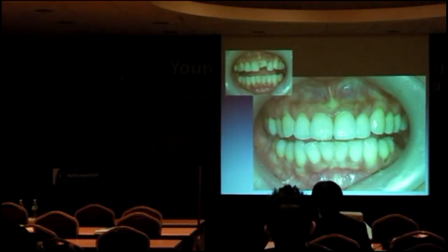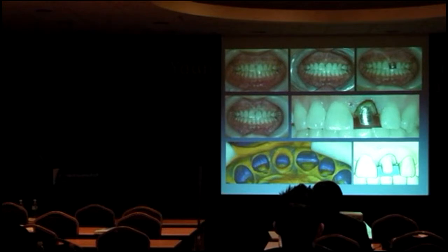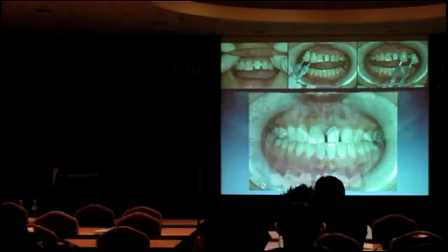This is the end of the single tooth case. The other single crown has a metal porcelain core, which may affect the result because of the metal reflection during the intraoral scan. I made the conventional impression with polyvinyl siloxane, and I also scanned it, and I made a model and used the data to fabricate this coping. Then I did the same thing.